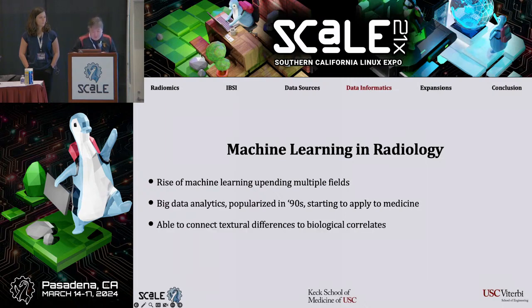And then finally, the problem is we are dealing with images that are mathematically reconstructed images of the human body, and then we're applying math to it to try to find something that separates these differences. And is all of this just a mathematical anomaly that we're calculating? Is there any correlation to actual biology or physiological differences? Once you get to the abstract layer of calculating metrics for textures and comparing individual values of these calculated things, does that really mean anything when you get back to the actual images that can be acted upon or that is physiologically related? Or are we just saying that through the benefits of math somewhere down the imaging pipeline on this one machine, we're able to detect differences between these two? And then we get into this entire black box argument of what are we actually looking at.